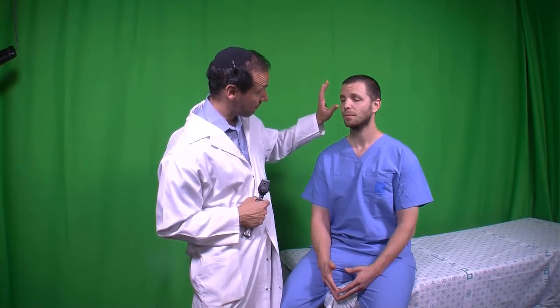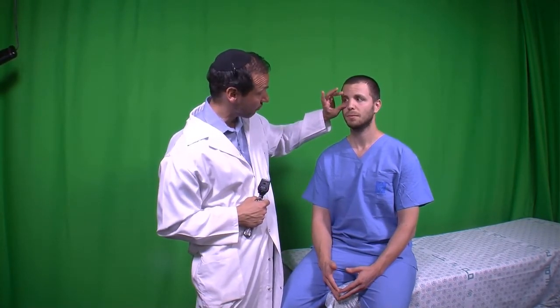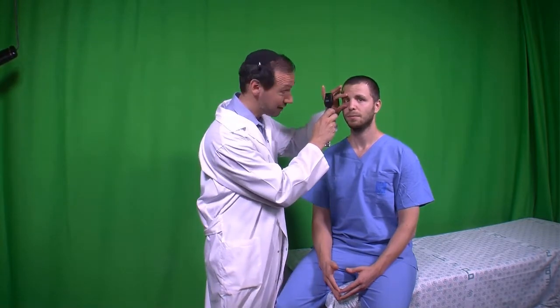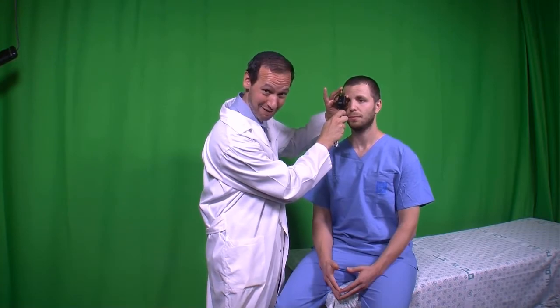The use of your left hand is very important. And what you're going to do is you put your thumb underneath the eye, and then I use my fourth finger, or my third finger, and put it right on his eyebrow. One of the things that this helps me reassure is that I'm always worried that I might push the direct ophthalmoscope into his eye, and having my finger there I know is blocking me from doing that.